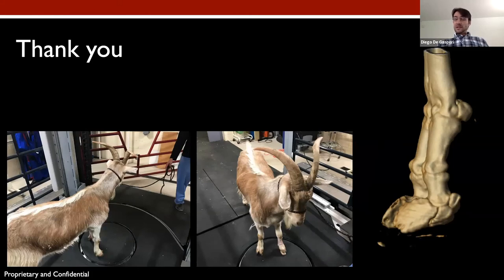And this particular case was quite useful, as it is in most cases, because this goat developed a severe lameness on the left front limb, and it was radiographed in the field with beautiful radiographs. Unfortunately, no fracture line can be seen on those radiographs, and they're very good quality radiographs. So we decided to CT him, and he stood quite well. It was quite interesting to do him.